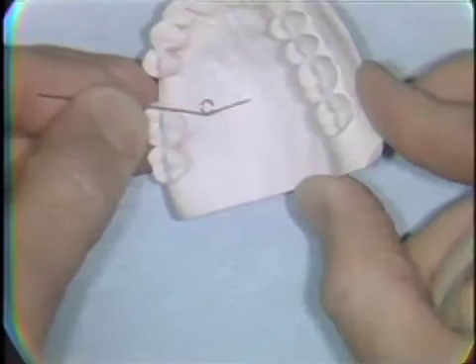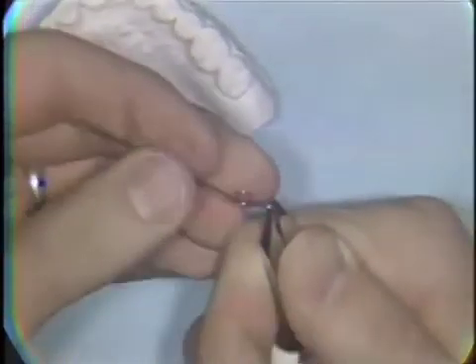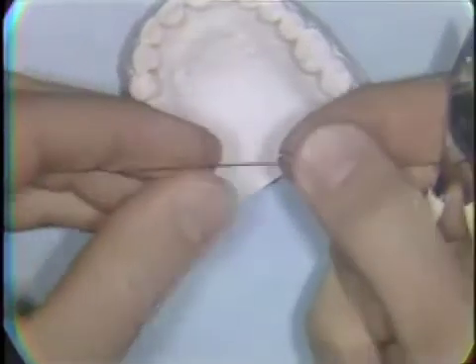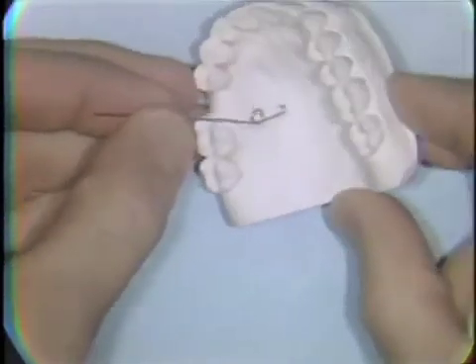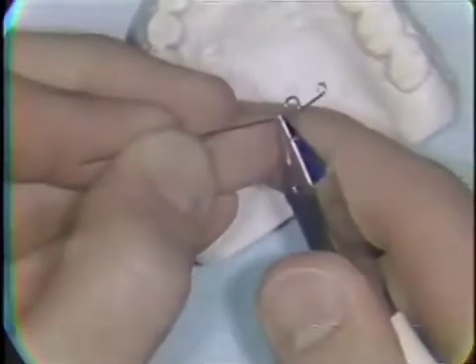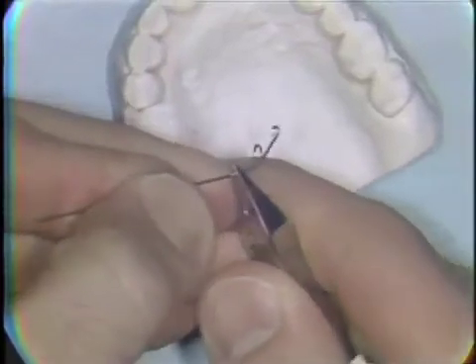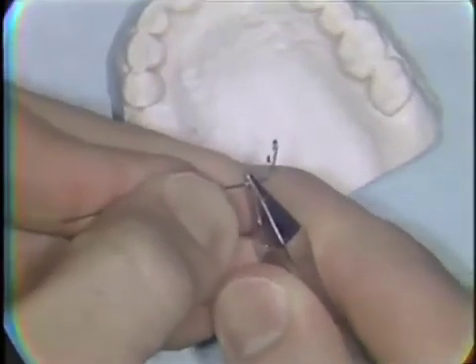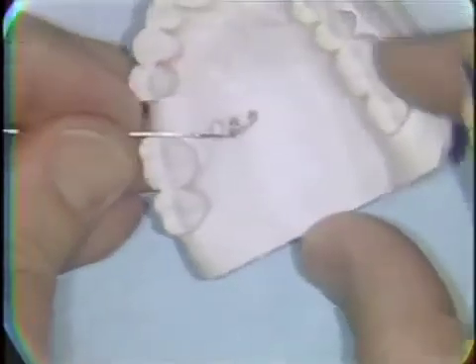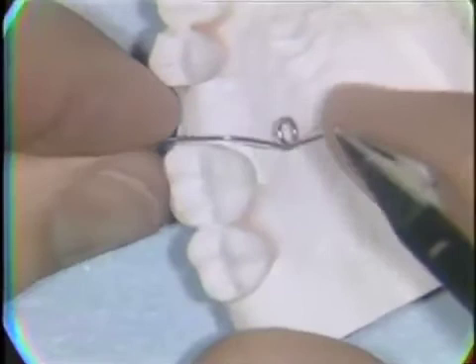A small loop for retention in acrylic is bent into the palatal extension of the spring. With a series of small bends, the wire is adapted to contact the palatal tissues and to extend upward to its point of contact with the mesial surface of, in this case, the first permanent molar tooth to be moved to the distal.